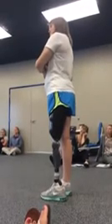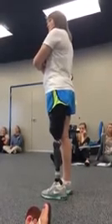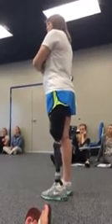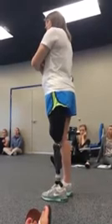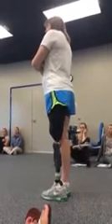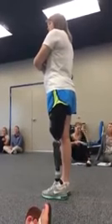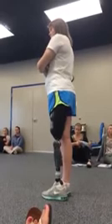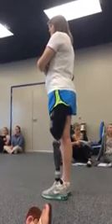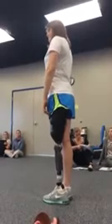One of the ways to figure out if the knee is flexing enough is to look at what we call heel rise. In prosthetics, we call it heel rise. It's how much your heel rises before you actually go into swing. Technically, from a PT standpoint, that's initial swing, because it's initial swing here, and then you get mid-swing, and then terminal swing. But what you can tell is if her right heel comes up this high, then it would be really nice if her left heel came up that high. So that's a visual cue you can use to see if we're getting enough.